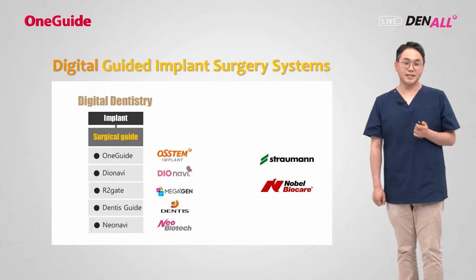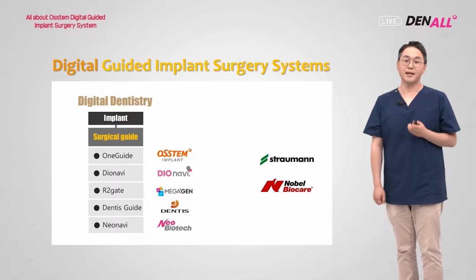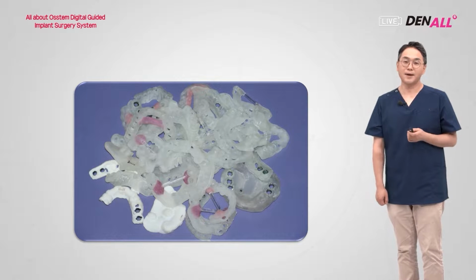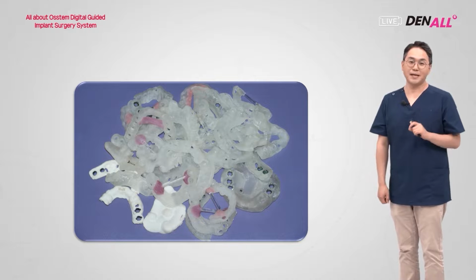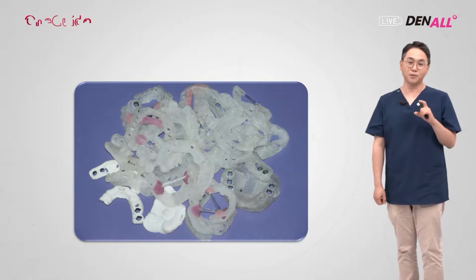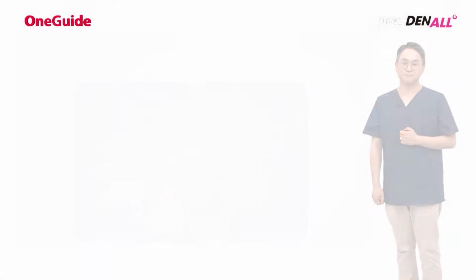As mentioned earlier, digital is all the hype. So all implant companies have launched a dedicated digital guide implant surgery system for implant placement. OSSTEM's digital guide surgery system is OneGuide. Each company has a different digital guide template. Some have a metal sleeve, some have an offset, which I'm going to mention in the next lecture. Offset has a fixed type and a variable type, and the offset length is all different. If you want to use OneGuide well, you need to understand its characteristics.